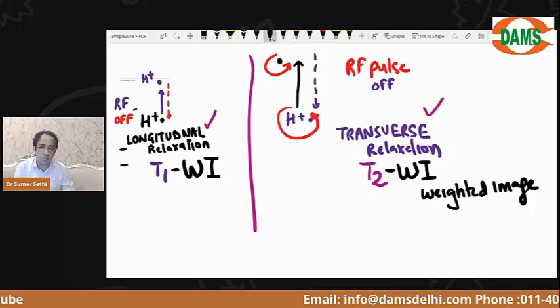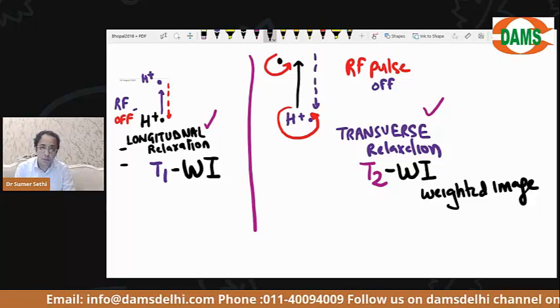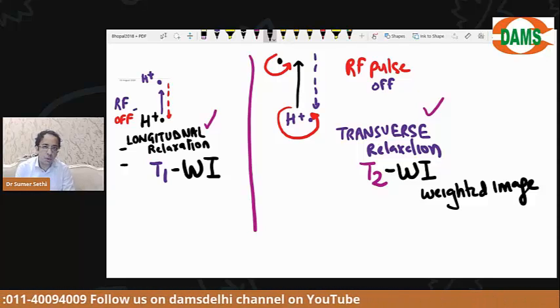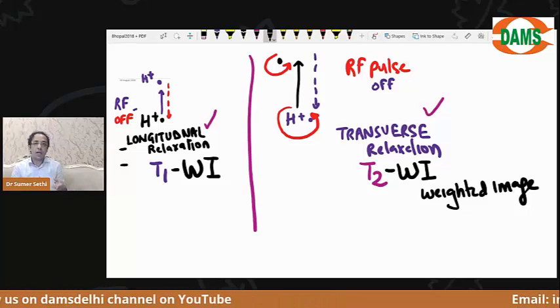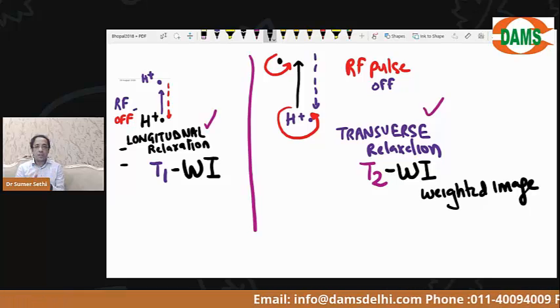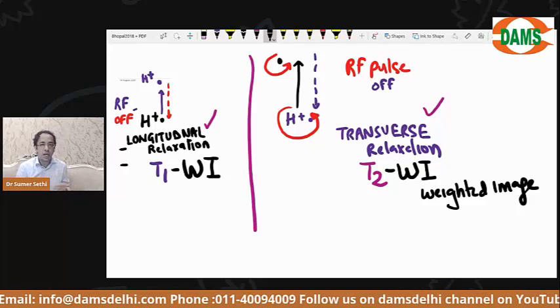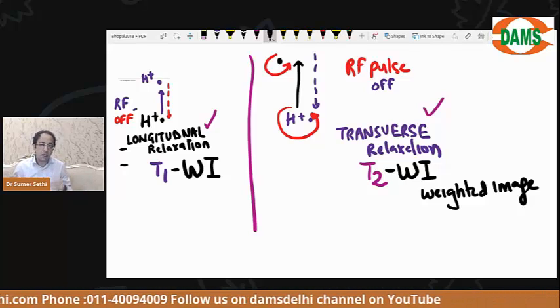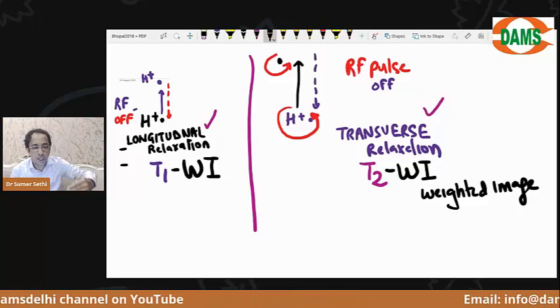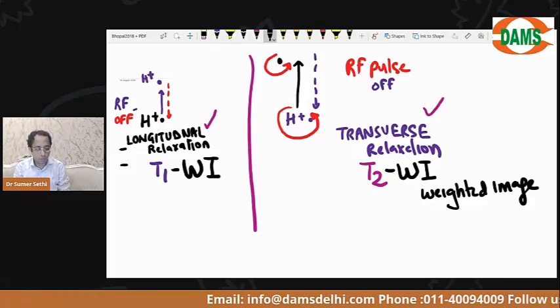So radiology has a little bit of physics involved in it. Gradually I will introduce you to the radiology physics also. MRI has to be based on some magnetic properties. Have you ever wondered what magnetic property we are looking at in MRI machines? We are looking at the behavior of the hydrogen ions. Whenever we change the magnetic field, the hydrogen ions change their position as well as their spinning axis. When we switch off the change, the hydrogen ions recover their position in time T1 and they recover their spin in time T2. Everybody clear?